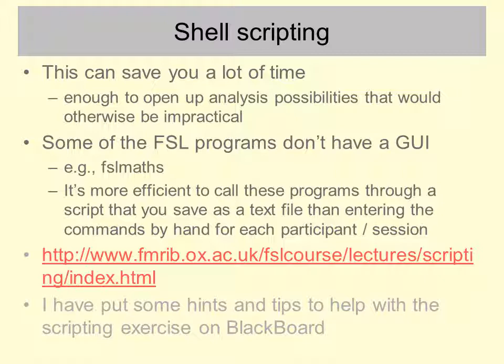So we'll do the scripting exercise that the FSL group at Oxford provide, and I've just put some helpful hints and tips for that on Blackboard, and I've printed that out as well.